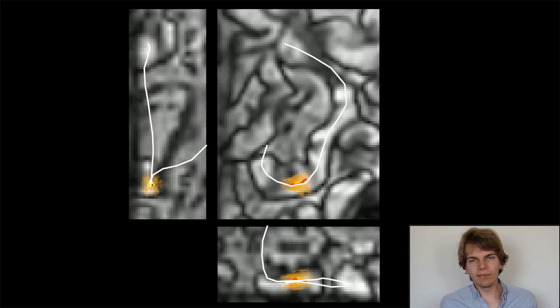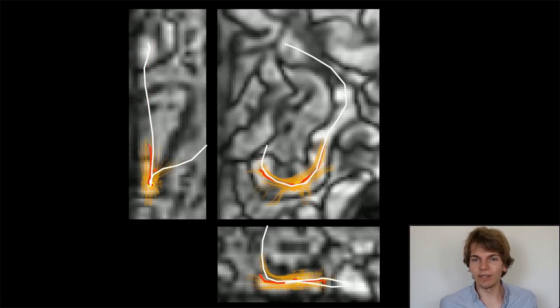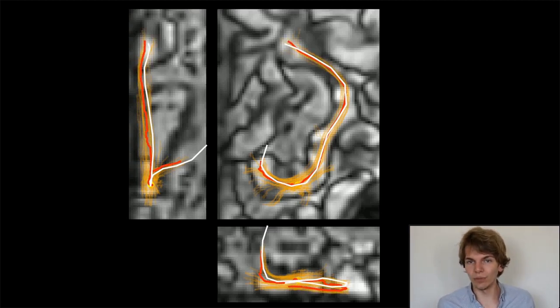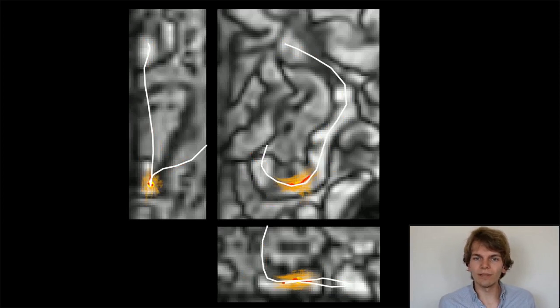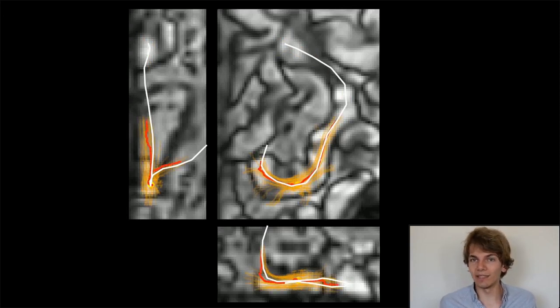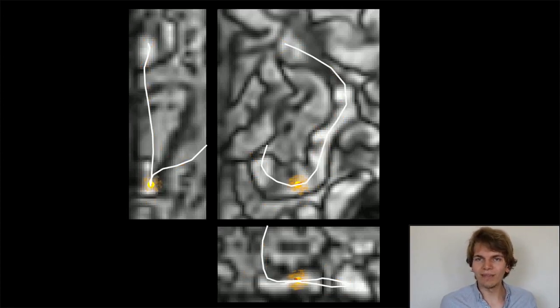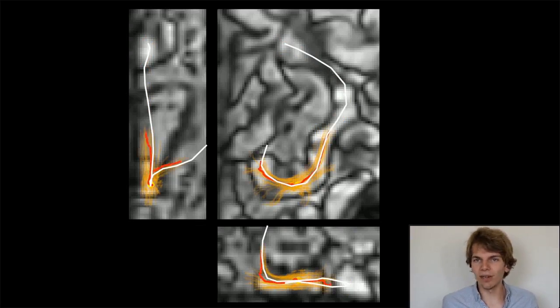Here is a visualization of this stochastic tracking algorithm in action, shown from three directions. In white we have a projection of the ground truth, in yellow the manual start point, in orange all of the tracking agents, and in red the trace of consensus positions — which is also the output of the algorithm. We see some agents making mistakes, but as a majority of agents track this section correctly, these outliers are automatically ignored.